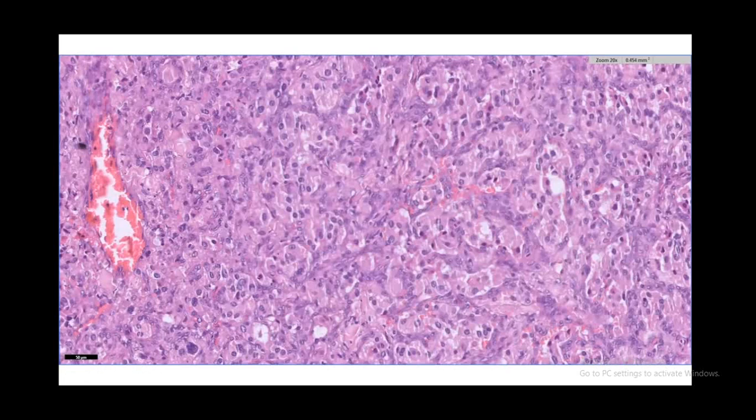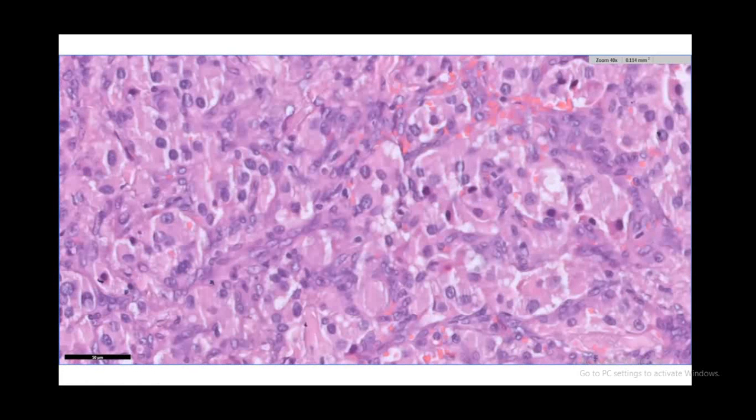On higher magnification, tumor cells show a very conspicuous nested appearance, or a Zellballen pattern, where these nests are separated by thin fibrovascular septa all around, and some random anisonucleosis is seen. Otherwise, the tumor cells are fairly monomorphic, and they show rounded nuclei with moderate to abundant eosinophilic cytoplasm. Hardly any mitosis is identified, and these nests can be appreciated better here.